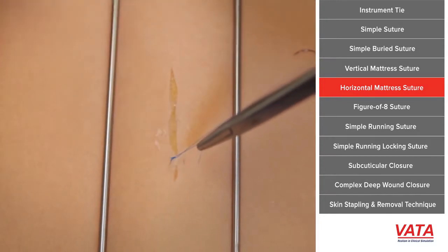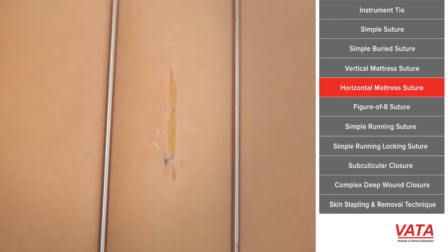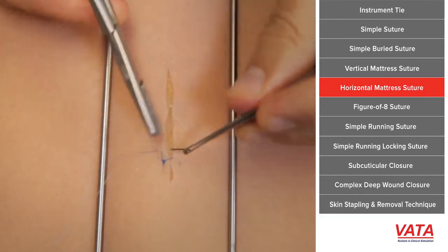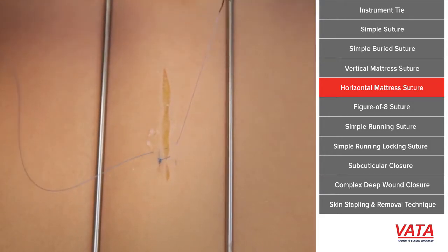Sometimes you want to pull tissue to tissue together, just like with a vertical mattress. The vertical is nicer because it does evert the skin edges, but in a case where eversion is not a problem, simply doing a horizontal mattress will help you.